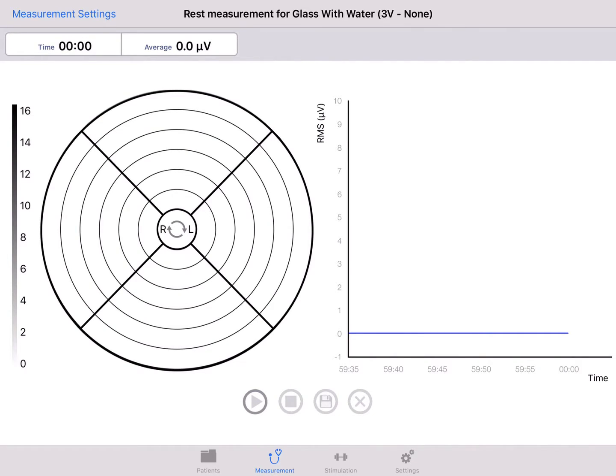On the left you see the maple grid. When a measurement is started, each electrode or section of the grid will be tinted in gray scale where white is zero and black is maximal activity.